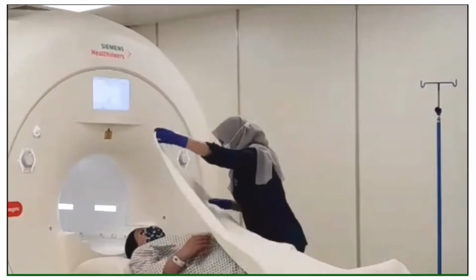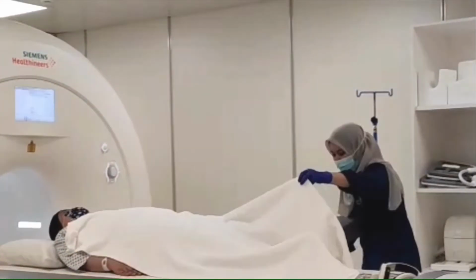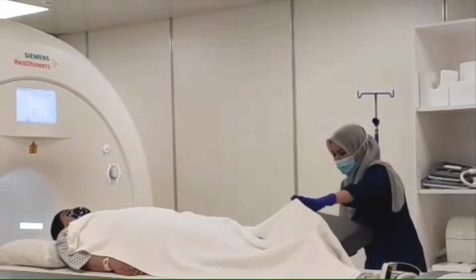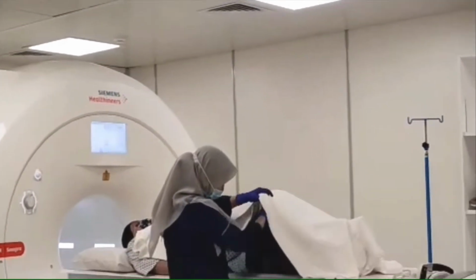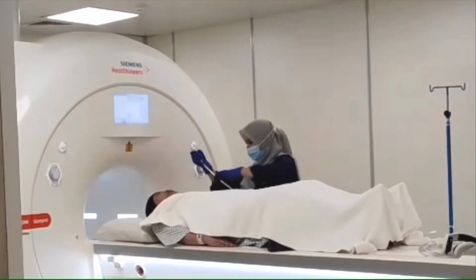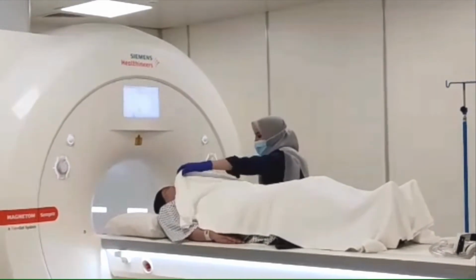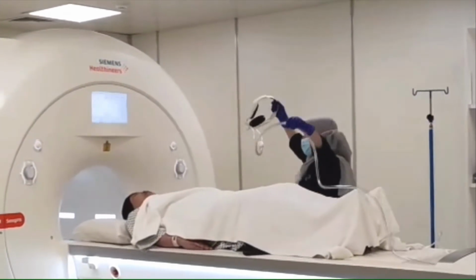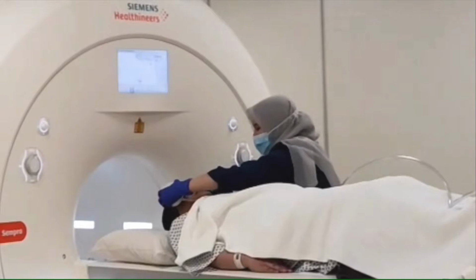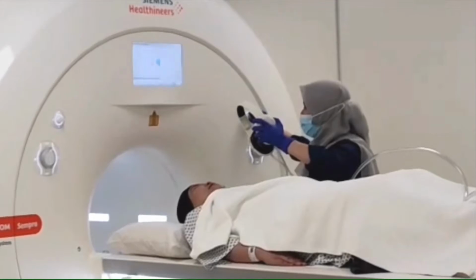Okay, as you can see here, this is the radiographer positioning. You have to take care of the patients inside the positioning area. Once inside the MRI examination room, the patient is up to us. We, as radiographers, have to position the patient in such a way that the patient will be comfortable. You can see the radiographer placing the immobilization aid below the patient's knee, and then giving the patient the call button so that they can call on us if there is an emergency or if they want to talk to the outside. We can hear them and they can talk with us, a kind of communication during the examination.